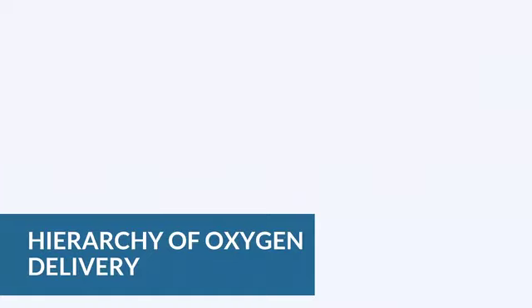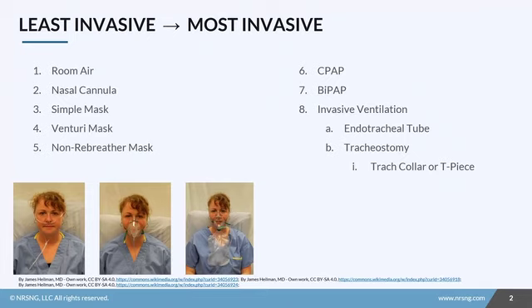We're going to talk about the hierarchy of oxygen delivery. Now, we've got a great cheat sheet about this, so make sure you check that out. But we just wanted to create a little video for you guys to help you understand the basics and the best ways to remember these things. So let's talk about these devices in order from least invasive to most invasive.